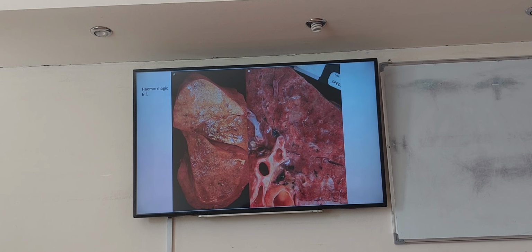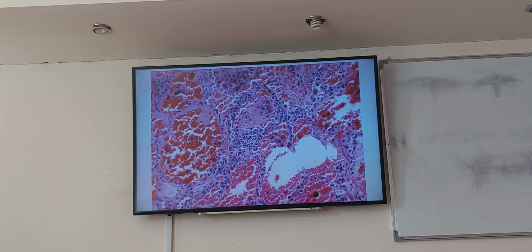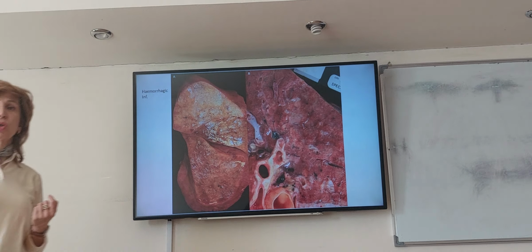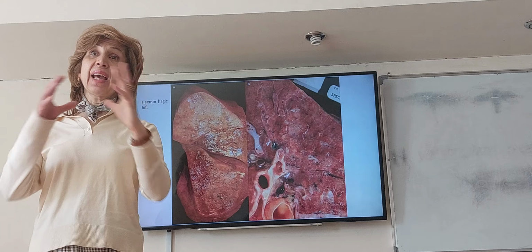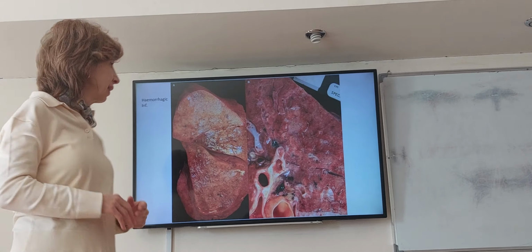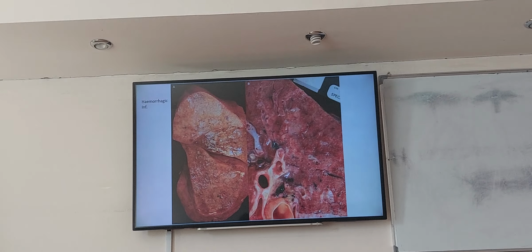Tell me, what is this? Hemorrhage. What do I see? Many hemorrhages with acute inflammation. So you just call it acute inflammation, which means that you see neutrophils, vasodilation, edema, etc. When you see excess red blood cells that are extravasated outside capillaries, or you see dilated capillaries also, it is hemorrhagic inflammation. And even with color, you see this dark color, this is due to hemorrhage.